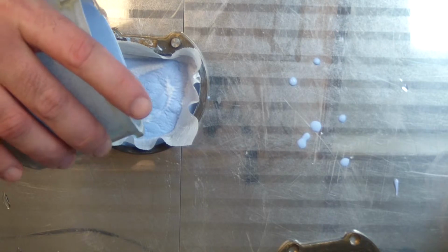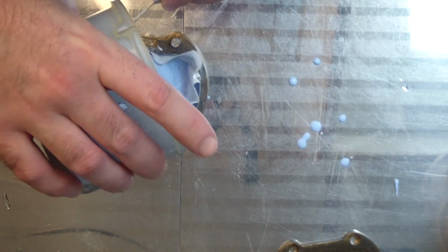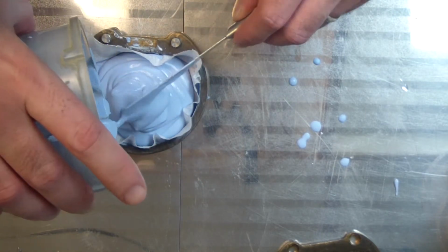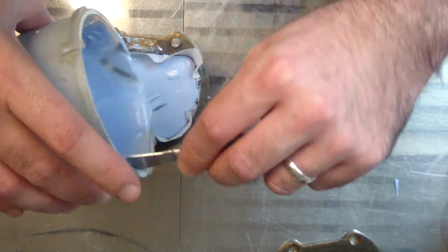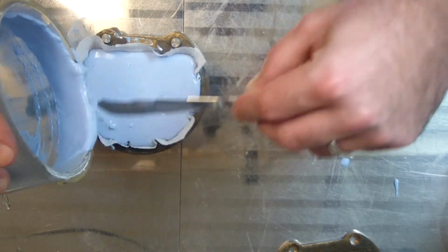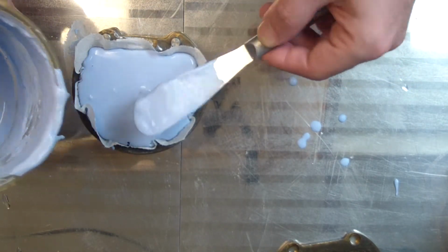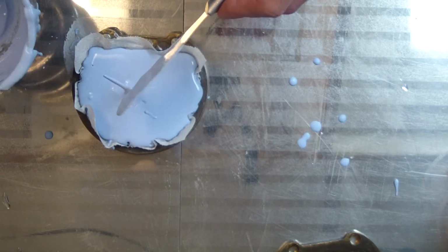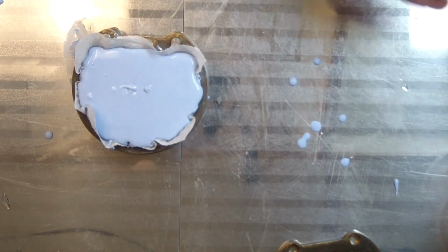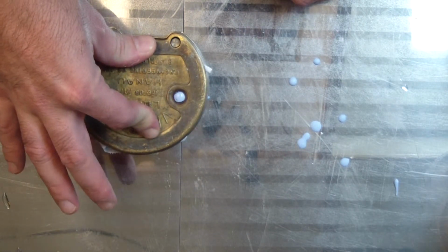And I'll just pour the remainder of my stone. Let me grab my spatula to make things a little bit easier. And 300 grams of stone usually covers about one flask for me. So I pour it till it's just about ready to breach, and then I'll stop, and then I'll take my cover, place it from back to the front, and kind of let it slowly go down, and then I'll apply pressure.